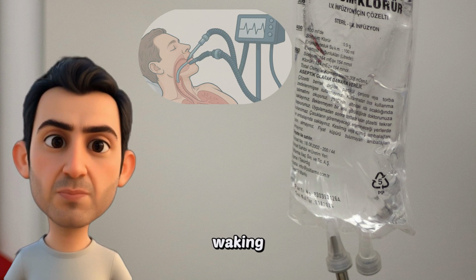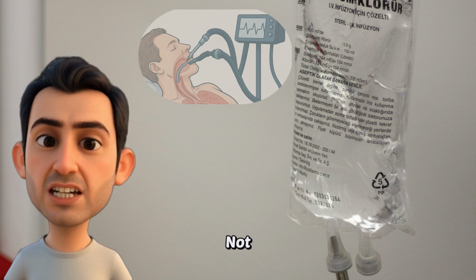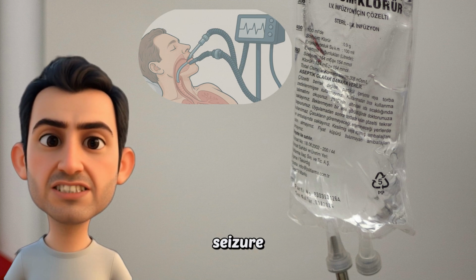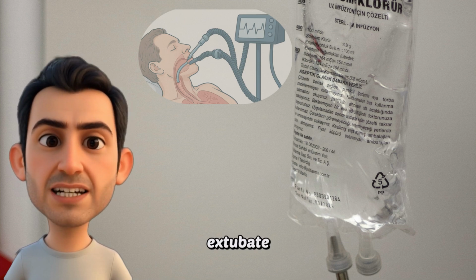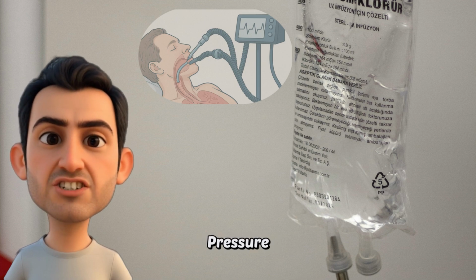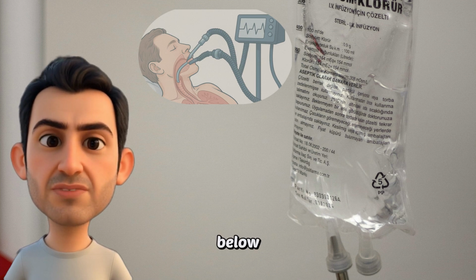Step 6, weaning and extubation. Let's say your patient is waking up, and their oxygen looks good. Do you need to keep them intubated? Not always. If the cause was reversible, like an opioid overdose or a seizure, you might be able to extubate in the emergency department. Here's your checklist. Switch to pressure support mode. PEEP at 5. FiO2 at or below 30%.